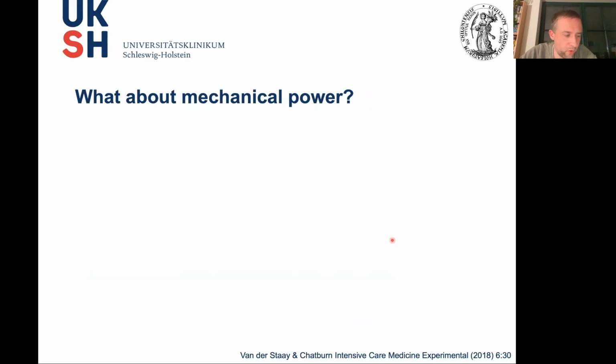What about mechanical power? Mechanical power is a subject that has been en vogue for a couple of years, but it's not really new. It's a very old concept, and it is based on calculation of work per breath, and then multiplying work per breath by the respiratory rate. Work is nothing but the integral of pressure times volume change during a breath.